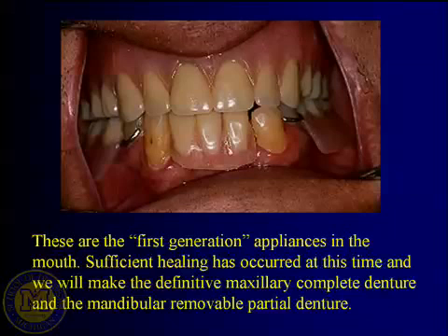I'd like them so white they make an aircraft landing light look dull by comparison. Okay, they don't say that, but when you start showing them the shade guide, you're into the bleach shades. Forget B1. We just had this last week. B1's not even close. I want like 14 shades lighter than B1, and it really looks weird, but they're the people that have to wear them, okay?